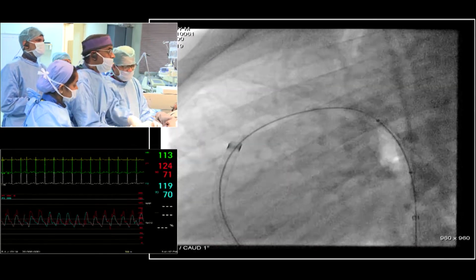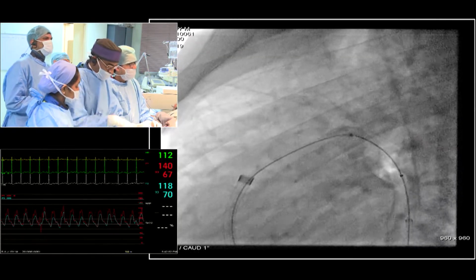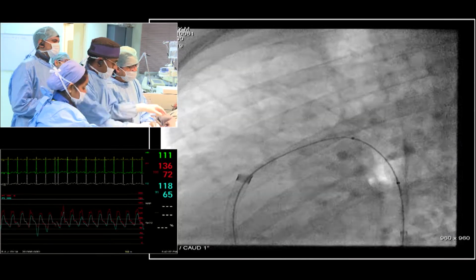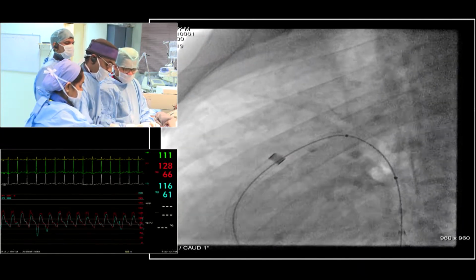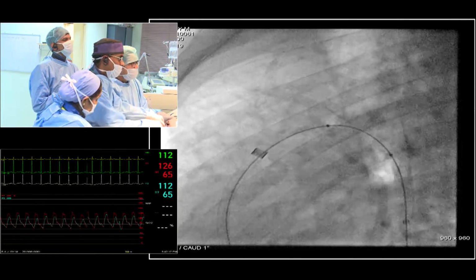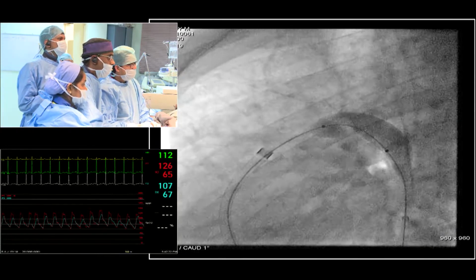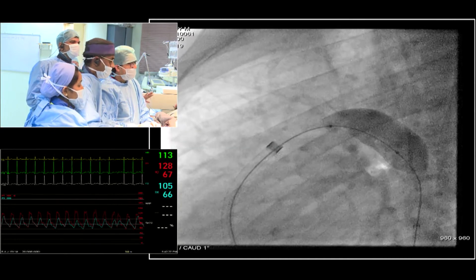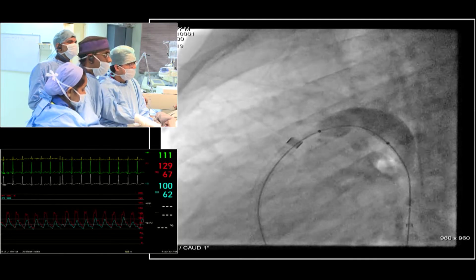How big of a stent do you want, and how much of a hole do you want? That is dependent on the size and the length of the sheath. So the duct is minimum 25 or 30 millimeters long. So you can use maybe a 20 millimeter device if it is expanded, and then use a 25 millimeter stent or in this range, with 4 or 5 millimeter diameter. So you can advance both together through the big sheath.